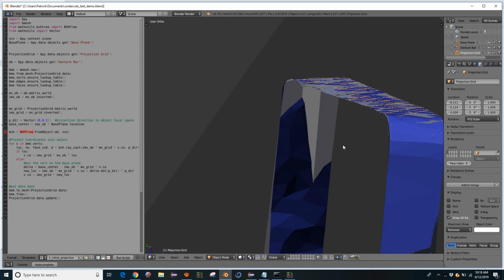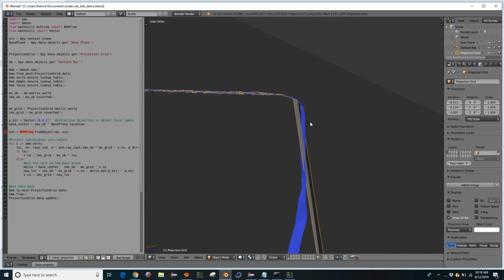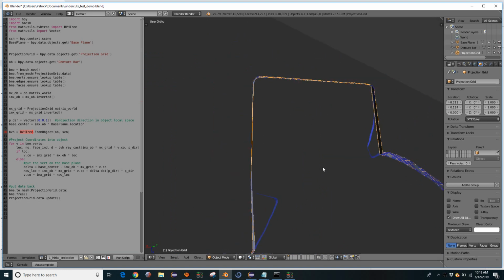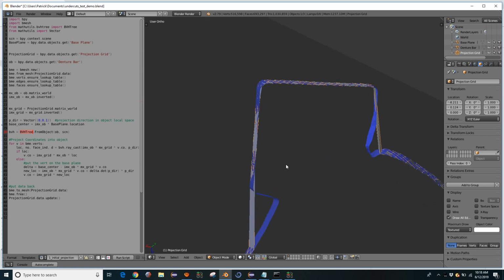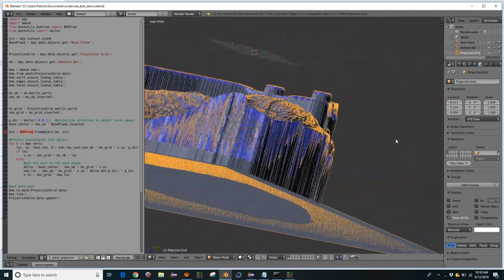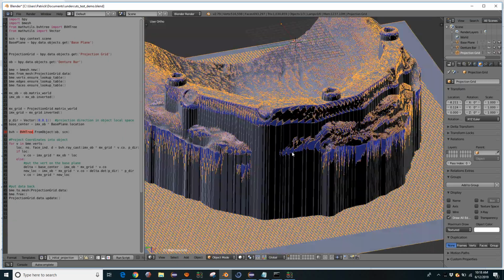But I'm going to propose a different technique, because this error is always at the worst spot, and the resolution you would need to make it insignificant is just going to vastly outweigh the benefits. The extra resolution here is not worth it computationally, and the results still won't be that great. So we're going to work smarter later, but this is a perfect introduction into a decent technique.